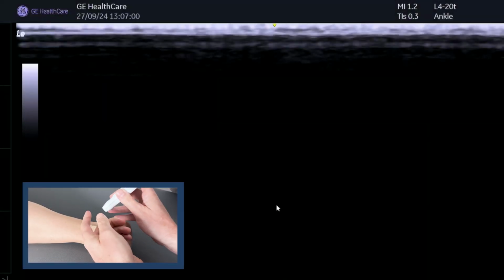Do you consider the knot of Henry with your medial foot pain? You should. I'm going to show you exactly how to find it. Now, just think of it as an intersection syndrome like you get at the wrist where FDL crosses with FHL. I'm going to show you two ways of finding the knot of Henry.